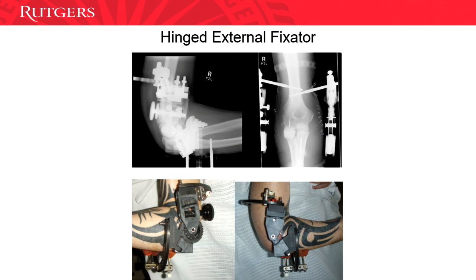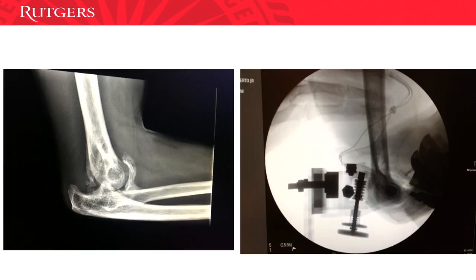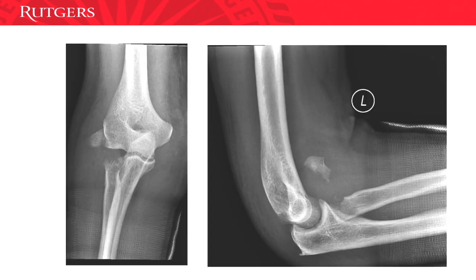And then again, hinged external fixator. There's a pin that has to go on the medial side, lateral side. You can get the ulnar nerve. It never works well. I've used it for chronic elbow dislocations, but it just doesn't.